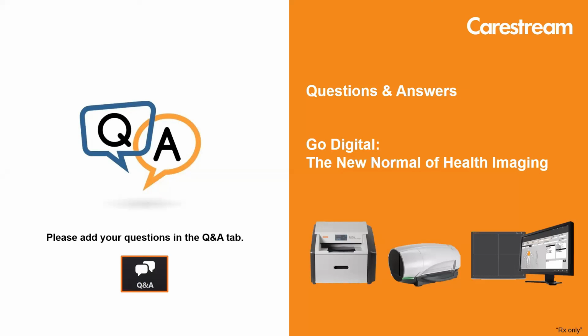In spite of this, detectors, of course, may suffer if they are dropped. If they are not handled properly, they may be sensitive to accidental damage. If the detectors are used in a normal way, there is no issue because there is nothing that wears inside.